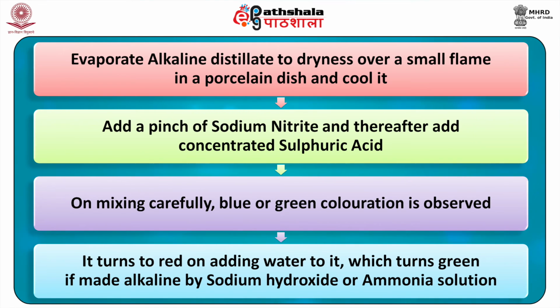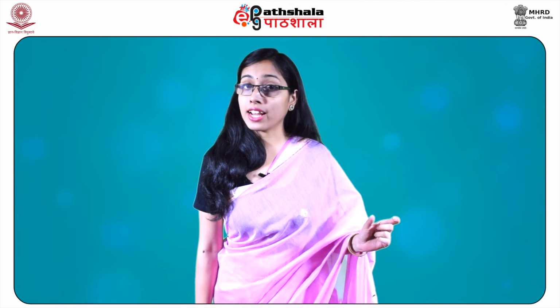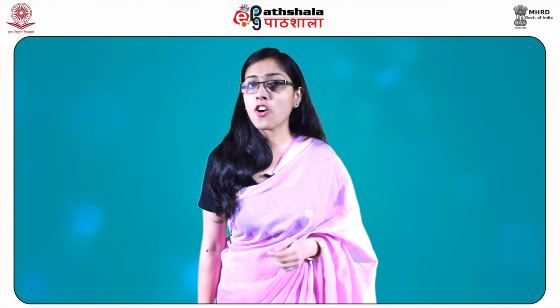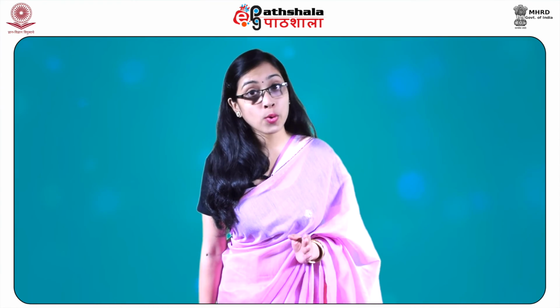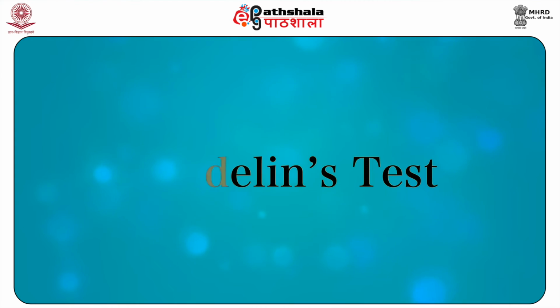It turns to red on addition of water and turns to green if made alkaline by sodium hydroxide or ammonia solution. Blue-red color indicates the presence of phenol, while the violet color indicates the presence of resorcinol. Green color shows the presence of alpha naphthol and beta naphthol. Brown to black coloration shows the presence of cresols and para-aminophenol.